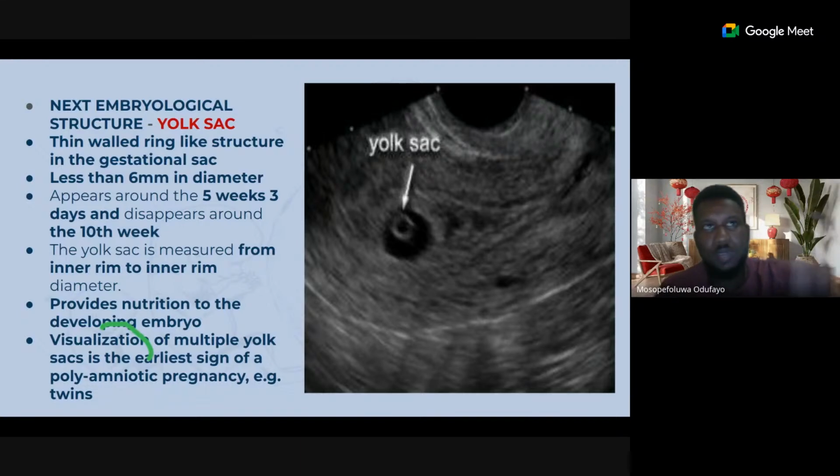A woman tells you her last menstrual period was the 1st of February, yeah? And then she comes for a scan, and this is probably the 3rd of March. That's just about 4 weeks, 3 days. First of all, I don't see why you should be trying to do an abdominal scan. I think you should suggest a TVS, because from the last menstrual period, she should still be around the age when she will be doing, what was it called?